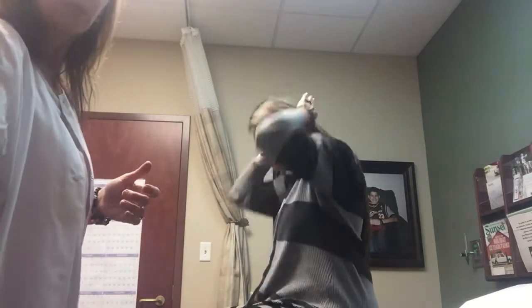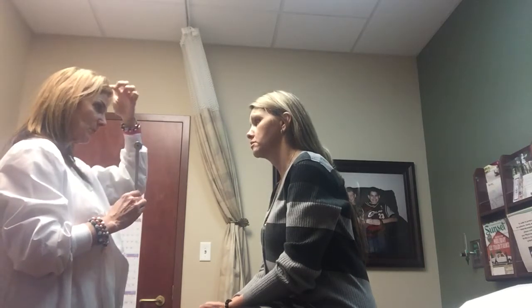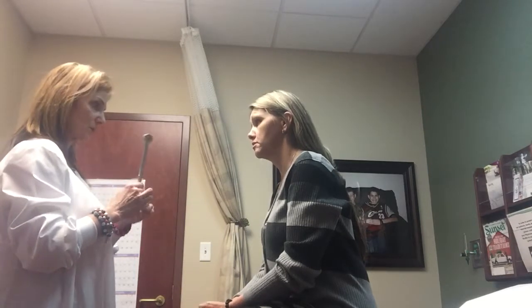And part of what I've been doing while I've been checking you is testing your hearing as you answer my questions, and you haven't had me repeat anything, so that shows me that you are able to hear pretty good, just in a normal range here. But we are going to do a couple more hearing tests, a couple different tests, and one is called the Weber test, and we're going to do that with this tuning fork. And what I'm going to do is make it vibrate and place it on the top of your head, and I want you to tell me if you hear it in one ear or in both ears, okay?